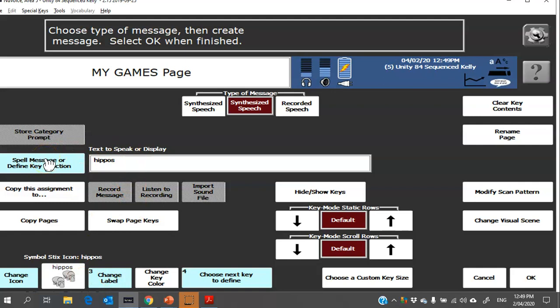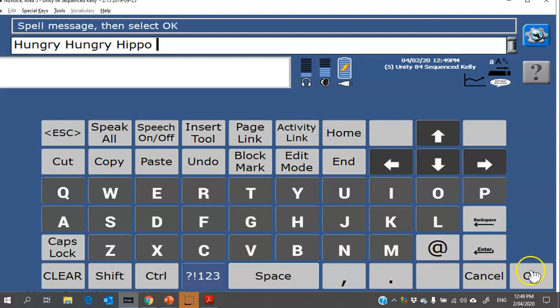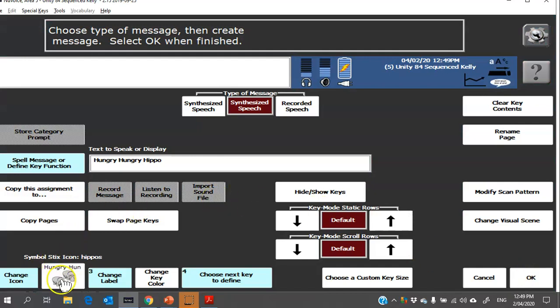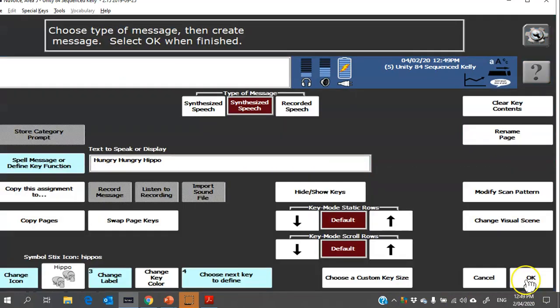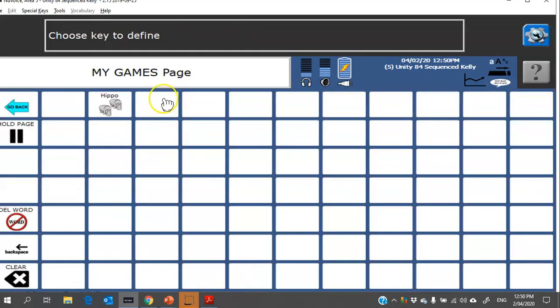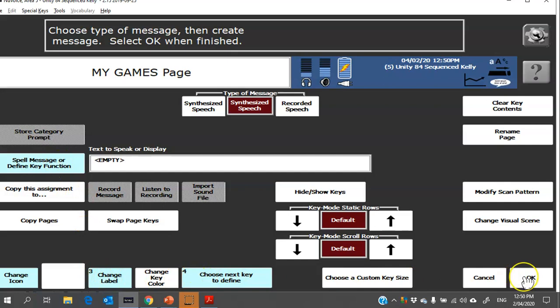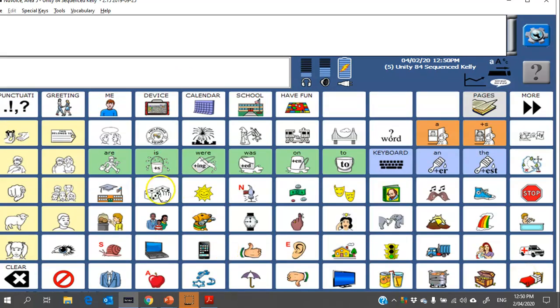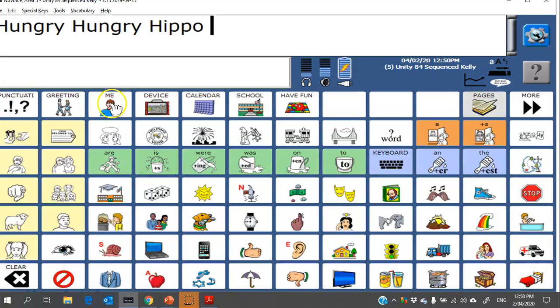When you choose an icon, you'll see it automatically will pop in the text to speak and it will change the label. But in this case the game's called Hungry Hungry Hippos, so I'm going to go here to spell message, delete what's there, and type in what I want that button to say. Always put a space at the end. All right, now I can also change the label, so in this case I might just have the label say Hippo. From here, if I'm finished editing I can click OK, or if I want to add some more games I can say choose next key. Grab another one and then follow those same steps to be able to add in another button. When you're finished you can just click OK. And I always like to check that it saved that word for me.